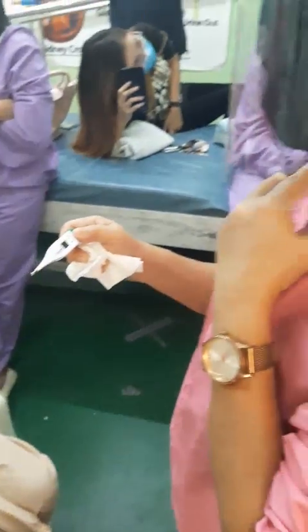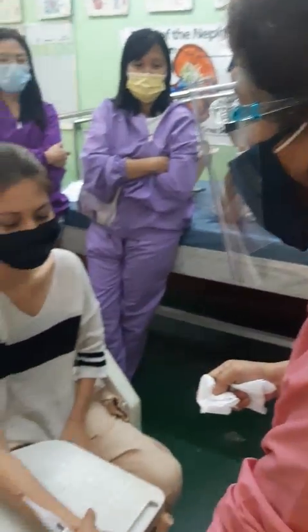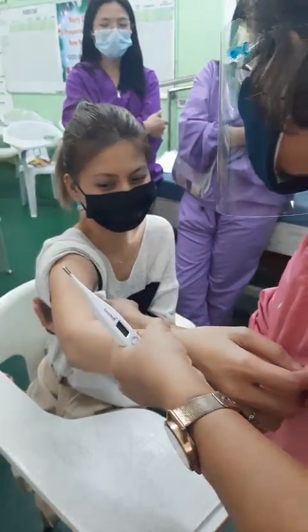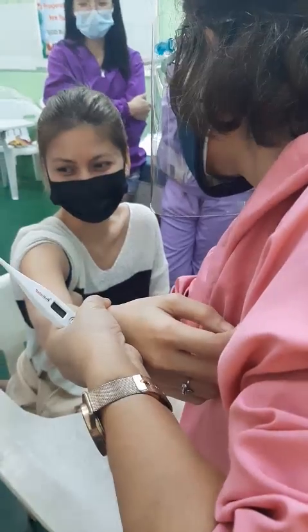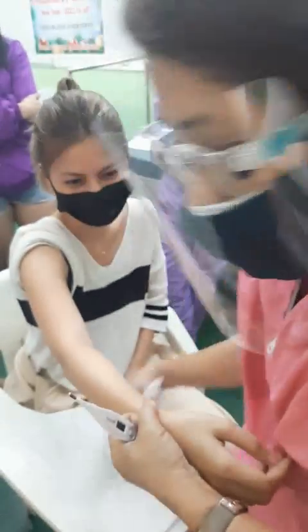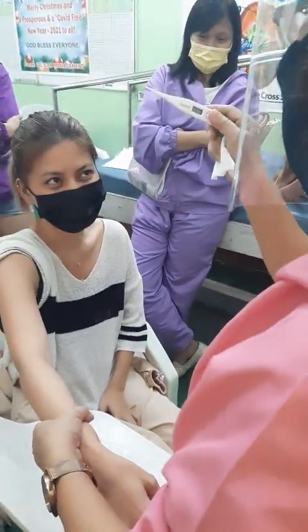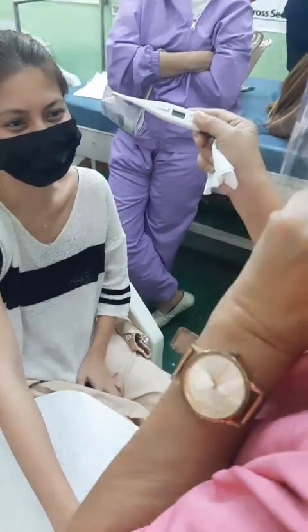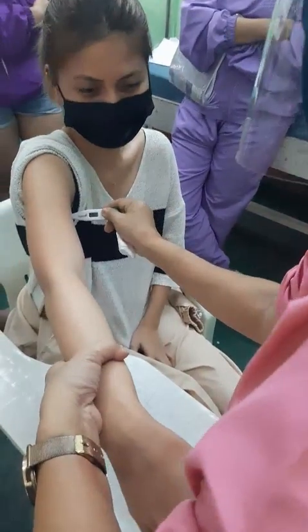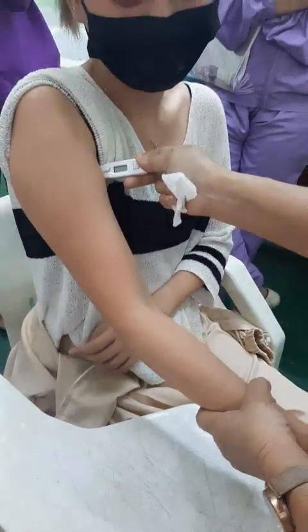Ma'am, I will take your body temperature. I will place this — the tip or the bulb — in the middle, very close to the skin under the axilla. This is the stem and this is the bulb, B-U-L-B. I will place it in the center, very close to the skin.